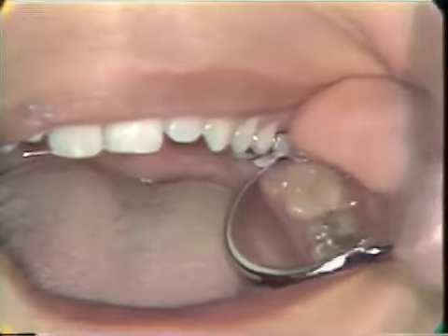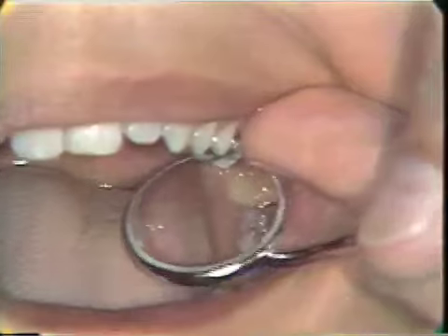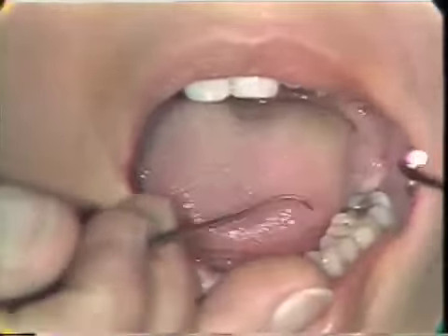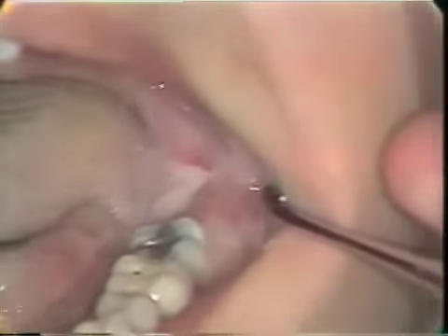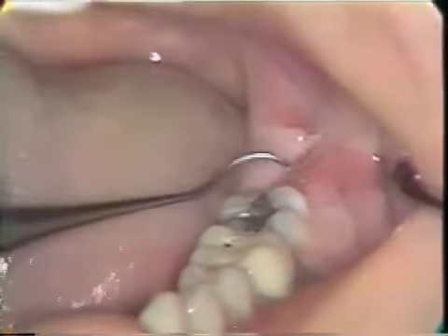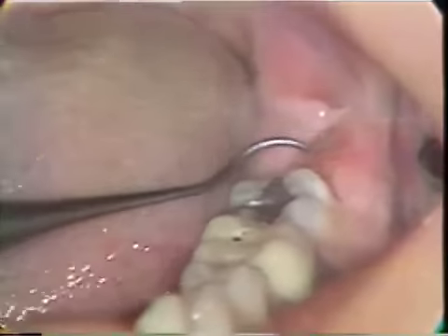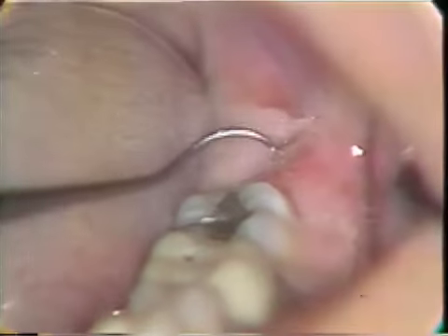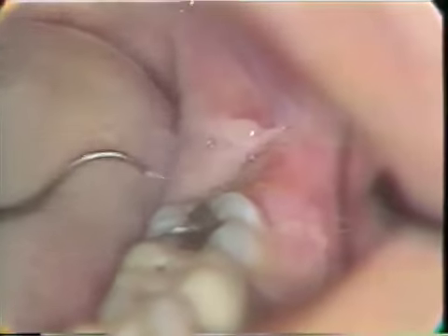Number 15 and 16 look good. Now let's check the mandibular teeth. Number 17 shows a good deal of inflammation of the gingiva around the coronal portion, pericoronal inflammation around tooth number 17.